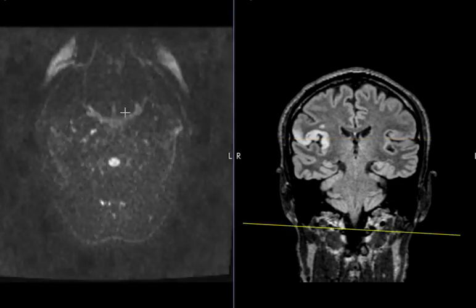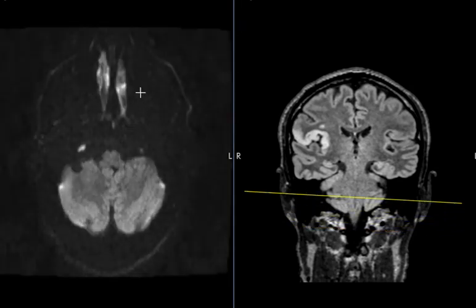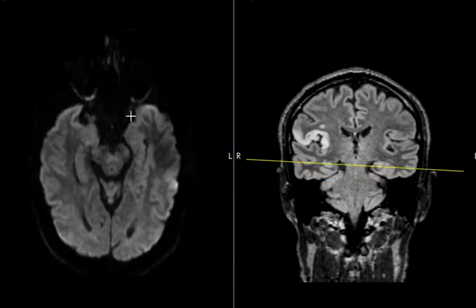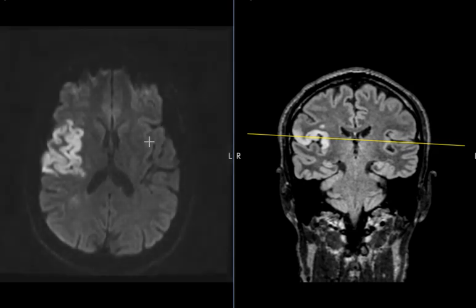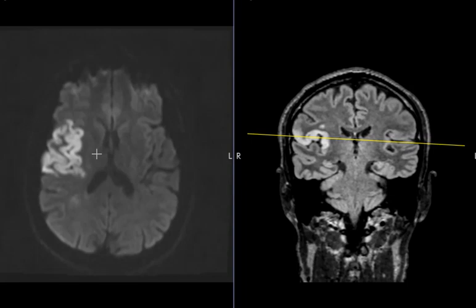If people have strokes or ischemic accidents, this diffusion sequence will show the abnormality as very bright. Tumors and other pathologies won't show it nearly as bright. We see this really prominent increased signal on the diffusion sequence, which is consistent with ischemia or an infarction of the brain. So this patient has had a right middle cerebral artery territory infarction — this is the MCA or middle cerebral artery territory here.